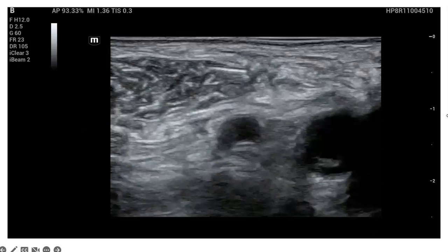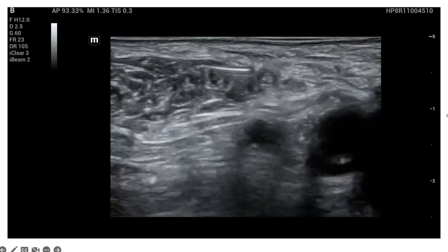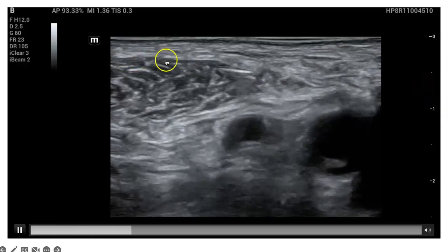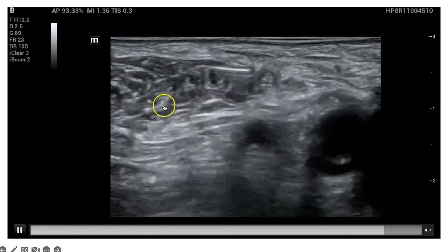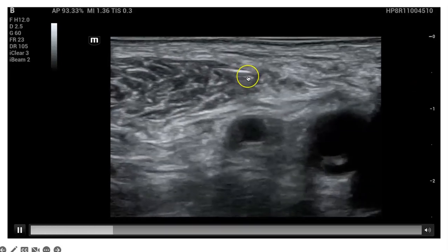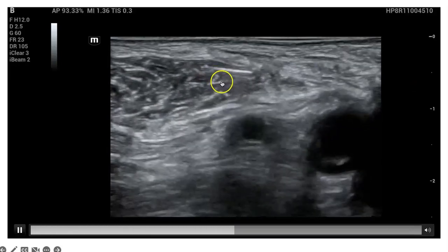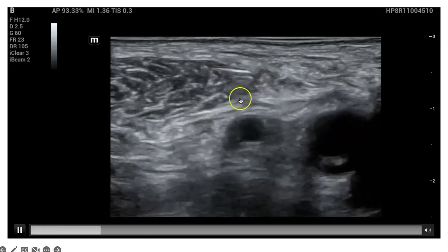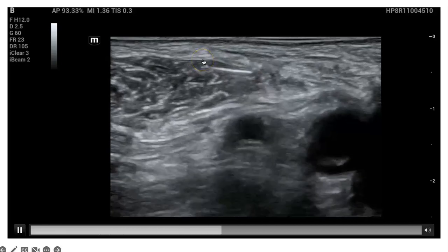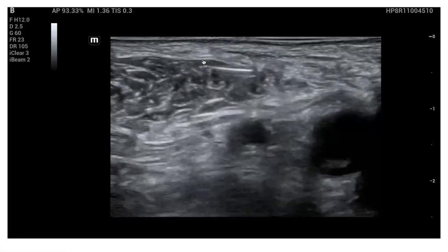To contrast that, here's a clip showing the needle still too superficial. Medial is on the right, lateral on the left. You can see the sartorius muscle with its distinct pointed shape. The needle is quite superficial, and when a couple of cc's of liquid are injected, you can see it dissects the muscle fibers apart but remains bounded within the muscle. If you saw this, you'd know to advance the needle a bit deeper and inject again to confirm you're in the correct plane.